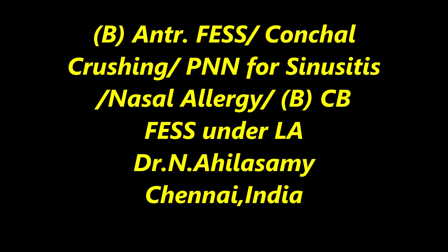I am going to show you a simple case of bilateral antiethmoid disease and maxillary disease along with nasal allergy and bilateral big concha bullosa.